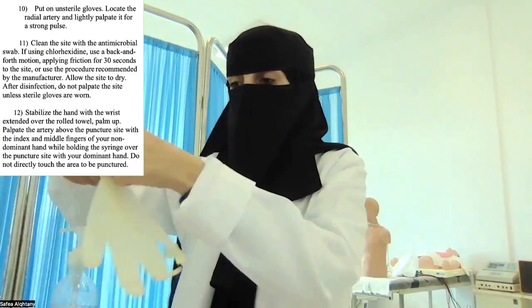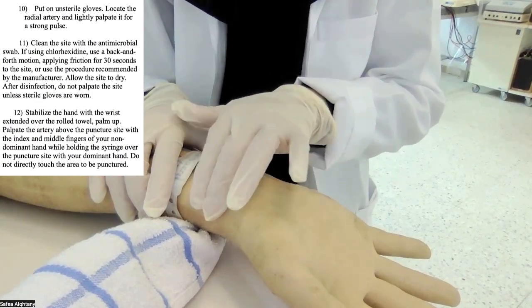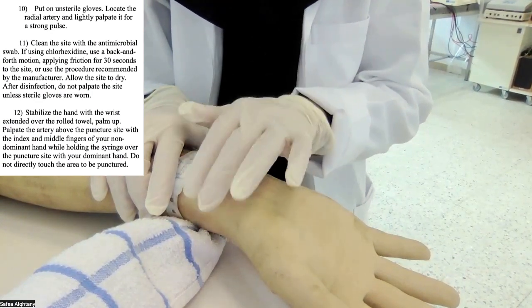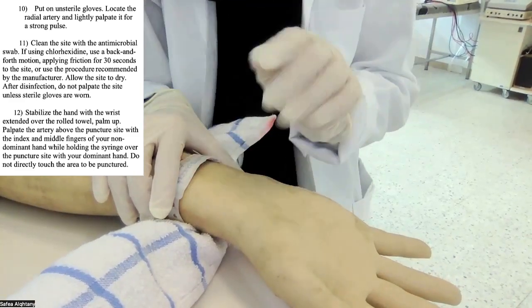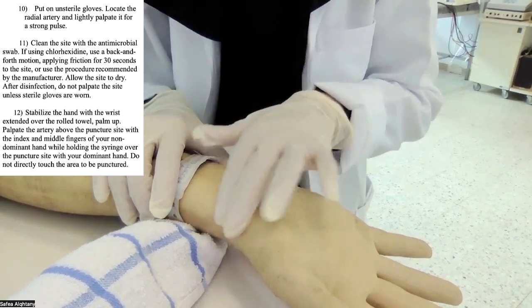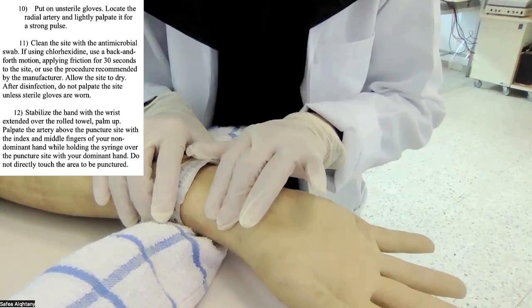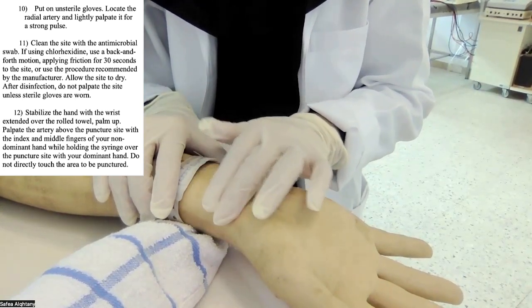طبعا عملت التست وخلصت. Now I need to put on gloves, clean gloves, and palpate for the radial pulse. يعني أبدأ أتحسس البلس. Okay, I don't need to apply a deep pressure, just light pressure, because if I apply a deep pressure, the pulse might disappear. يعني ممكن يختفي البلس لو أنا ضغطته بقوة. فالبلس يكون بشكل سطحي light pressure.